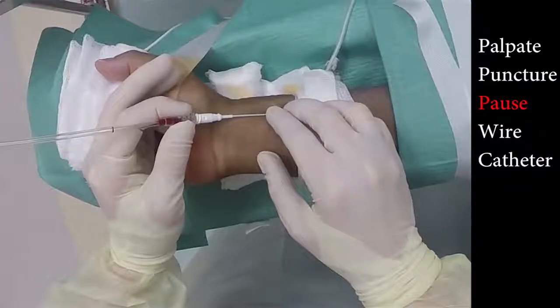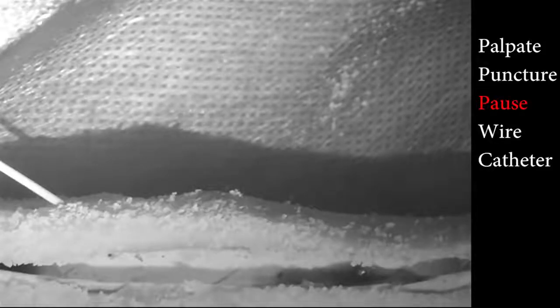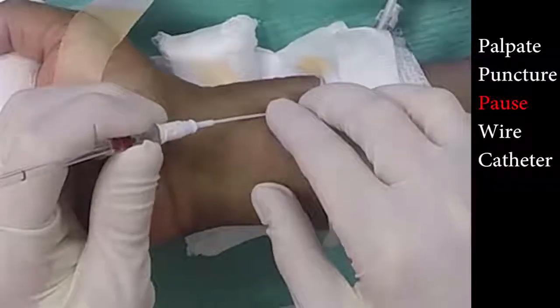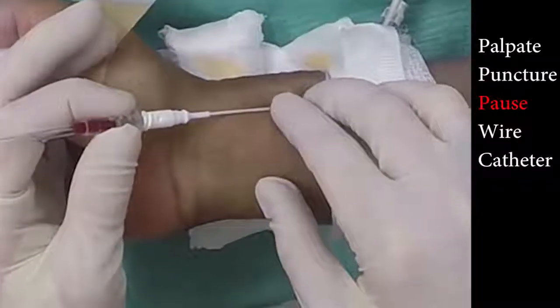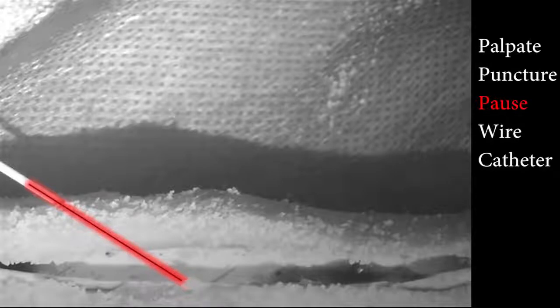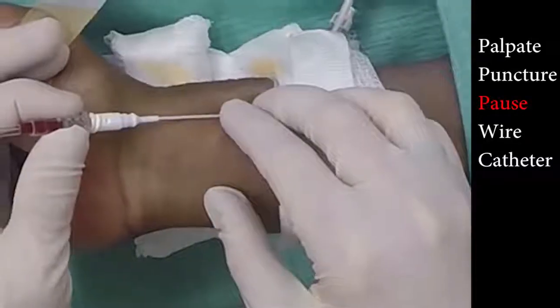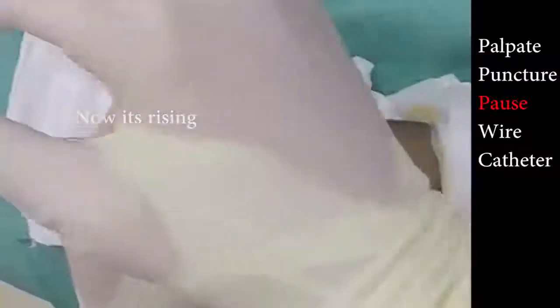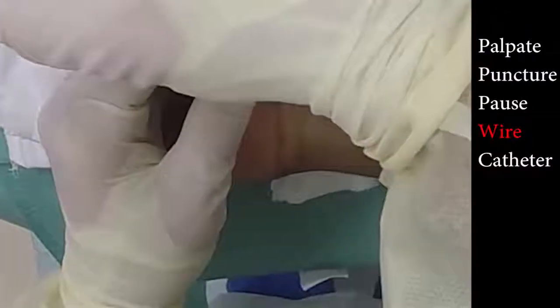It is quite tempting to immediately thread the wire when you finally see blood at your end of the Arrow catheter. We can't just be looking for blood in the catheter. We want rising blood, which can only be coming from a catheter inside the artery. If needed, slowly move the catheter millimeter by millimeter forward, then backwards, adjusting it until the blood again begins to rise. Drop your angle slightly. You can begin step 4, which is insertion of the wire.